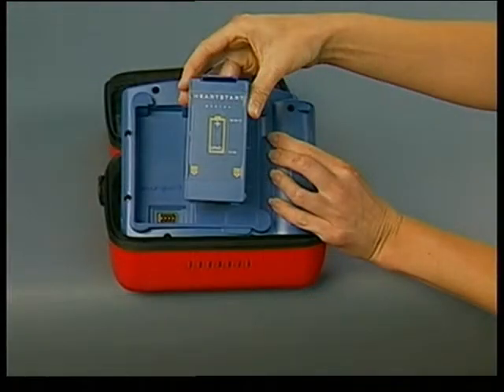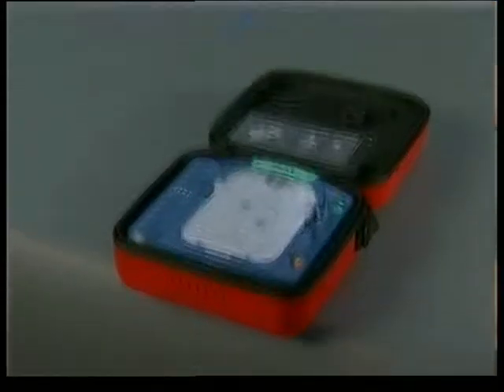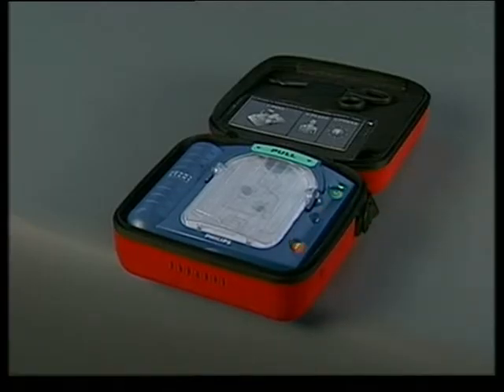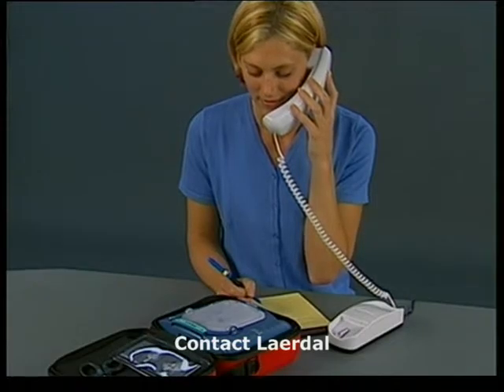When you install a new battery, be sure to let the battery insertion self-test run through both its interactive and automatic parts. The interactive part of the battery insertion test consists of verifying correct operation of the device's orange shock button. If the orange button is flashing, press it.